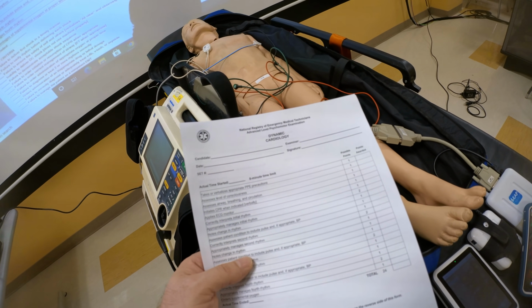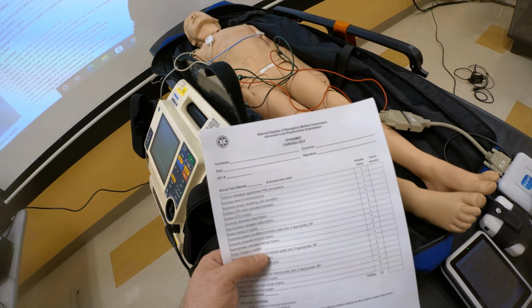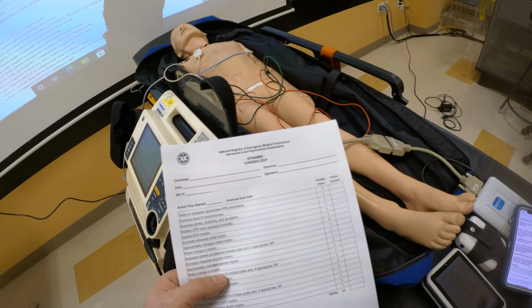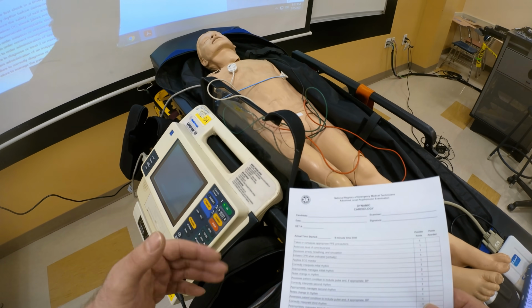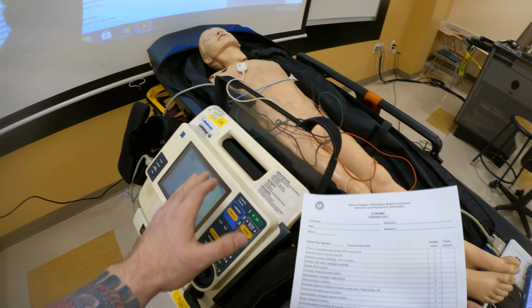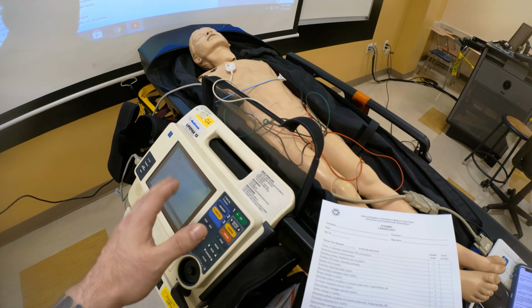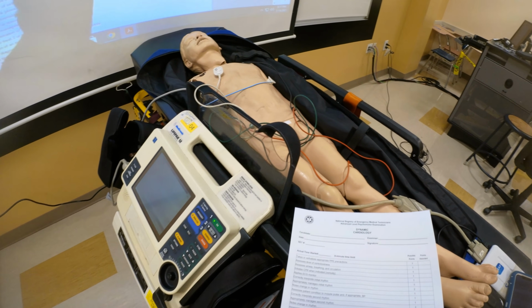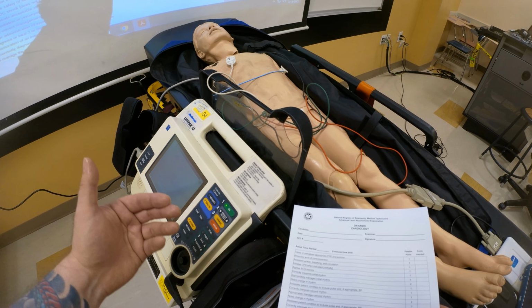The other thing I want to say that is often missed is AHA versus NREMT, right? So what's the biggest difference? We know with AHA, whenever we deliver a shock, we continue doing CPR for the next 2 minutes. We're not going to just stop and reassess if we see a change in the rhythm. More importantly, if we're doing active CPR, I don't care what monitor you use, even if you have filters, you're still seeing CPR artifact. So you cannot really see a true change in the rhythm. So for AHA in real life, after delivery of the shock, we're doing 2 minutes of CPR, reassess, 2 minutes, reassess, right?